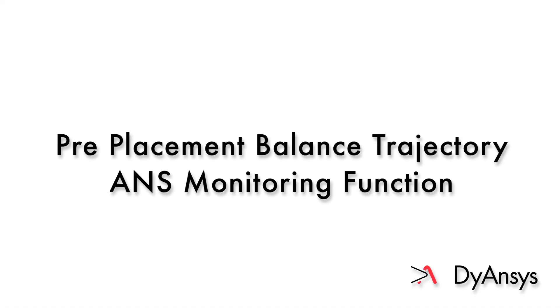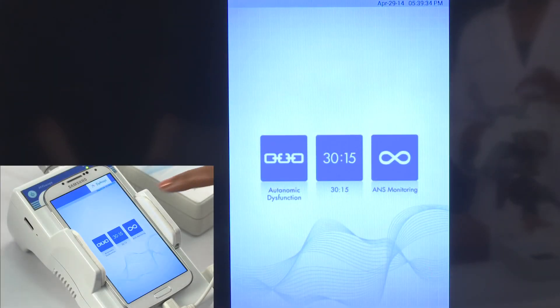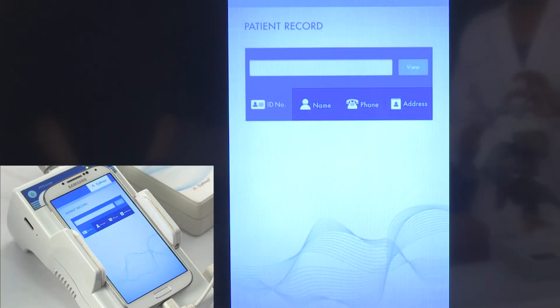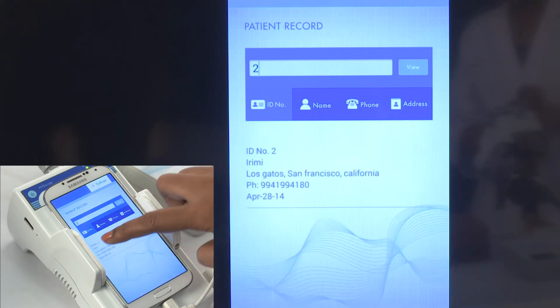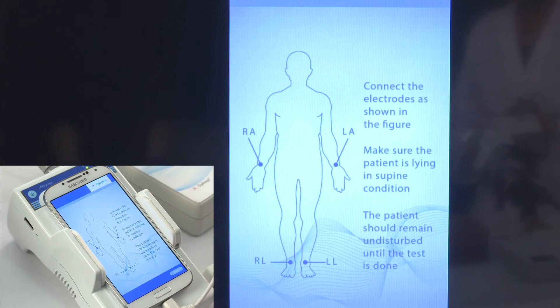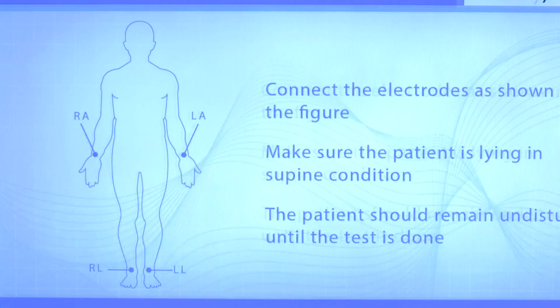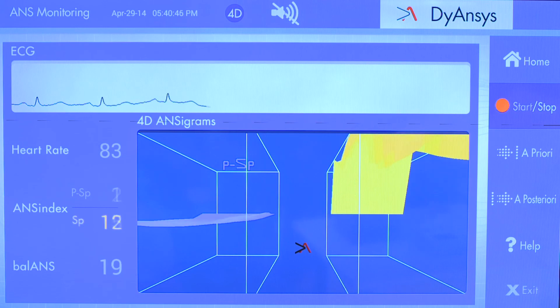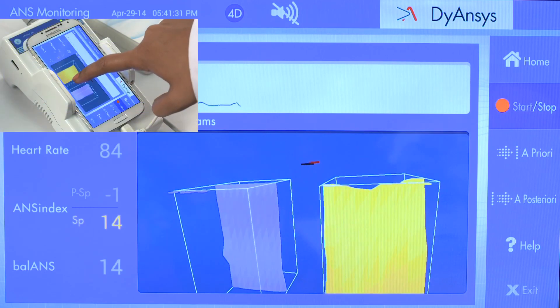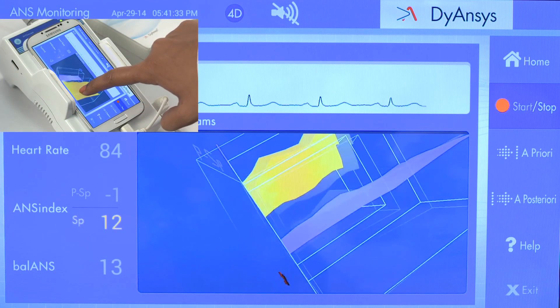Pre-Placement Balance Trajectory ANS Monitoring Function. Select the ANS Monitoring icon. Choose existing patient and search through ID, patient name, phone number, or address, and select the patient from the search list. Check the Lead Placement screen. Select the Start button in the ANS Monitoring home screen. You can view the 4D ANSYGRAM heart rate and other parameters.